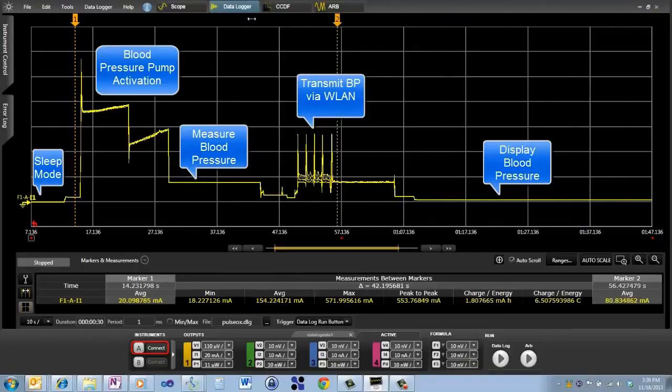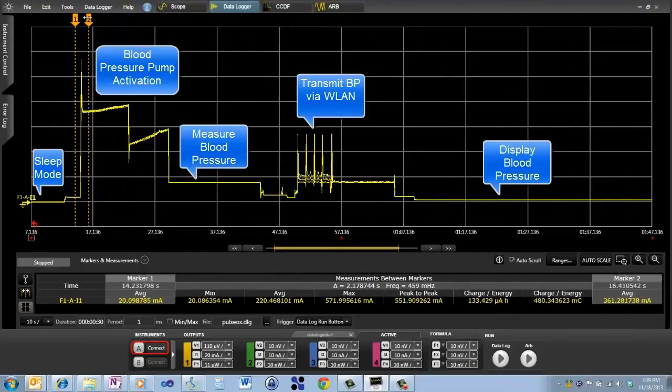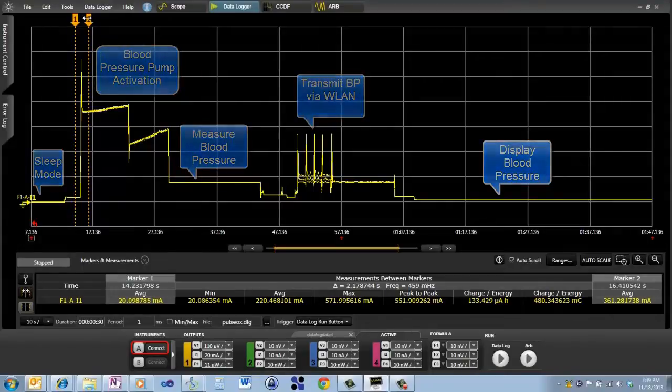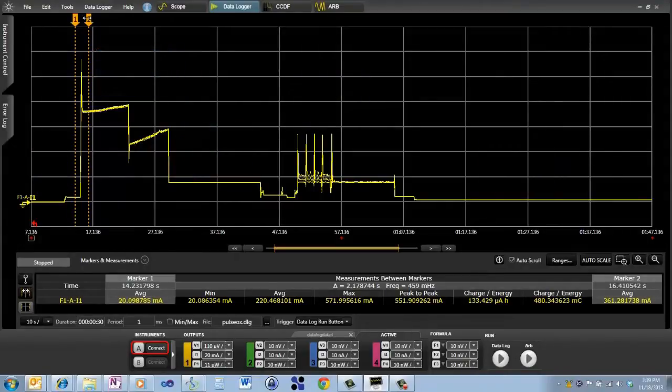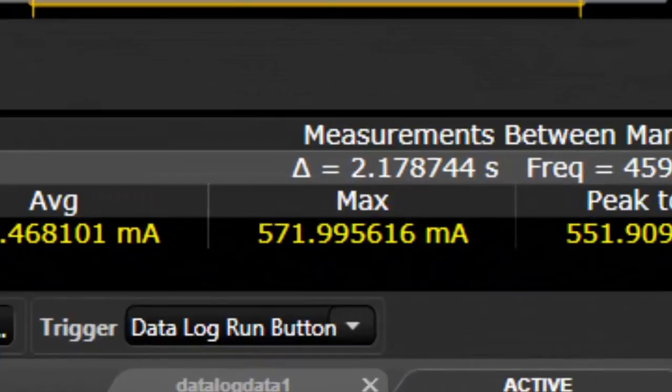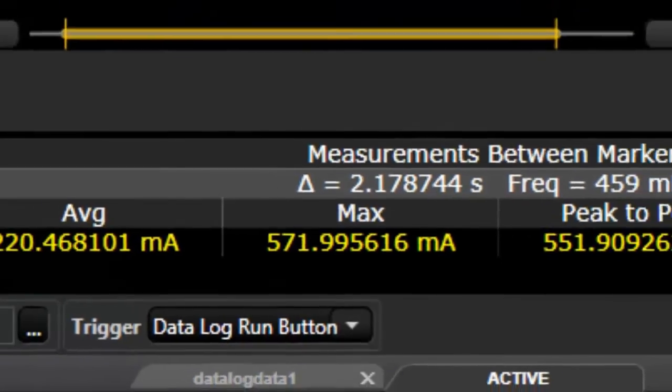And the first thing I'm going to look at is this peak. This was a peak when it turned on the pump and the blood pressure cuff was squeezing my arm. And you can see that the peak for this is about 570 milliamps.